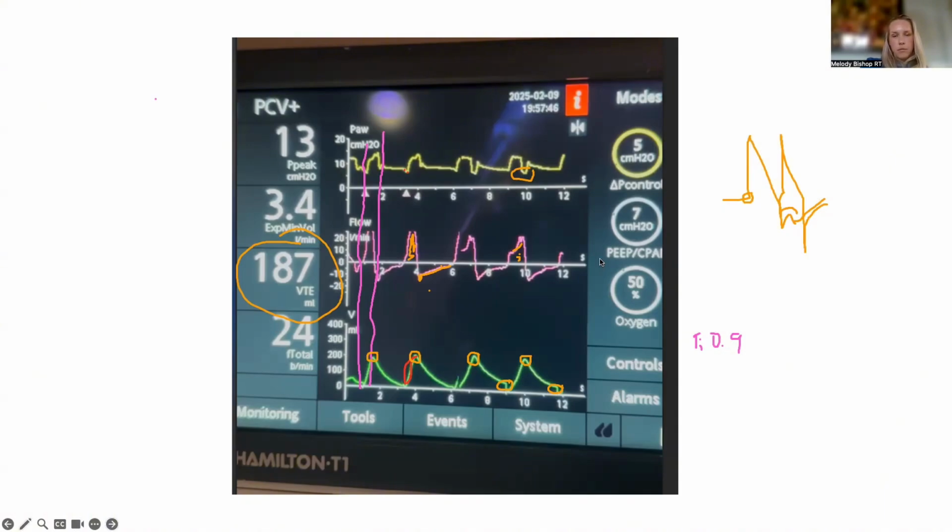and just allow the patient to trigger and get out of the patient's way, because some people classify this as early trigger. That's how the Cleveland Clinic folks classify it, not so much reverse trigger. They call it early trigger because the machine trigger is coming earlier than when the patient wants it. So the thought is if you drop the respiratory rate from, say, 24 to 12 and let the patient breathe at 15, then every breath would just be a spontaneous breath. You wouldn't have any reverse triggers in there, right?